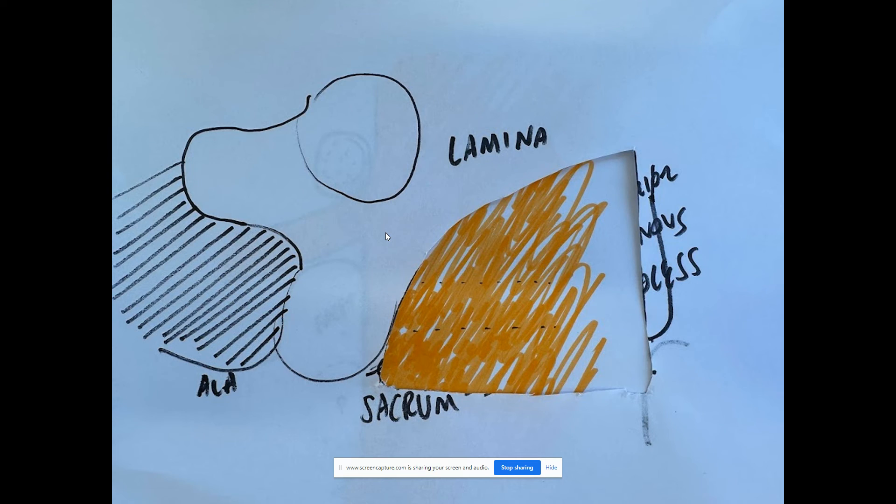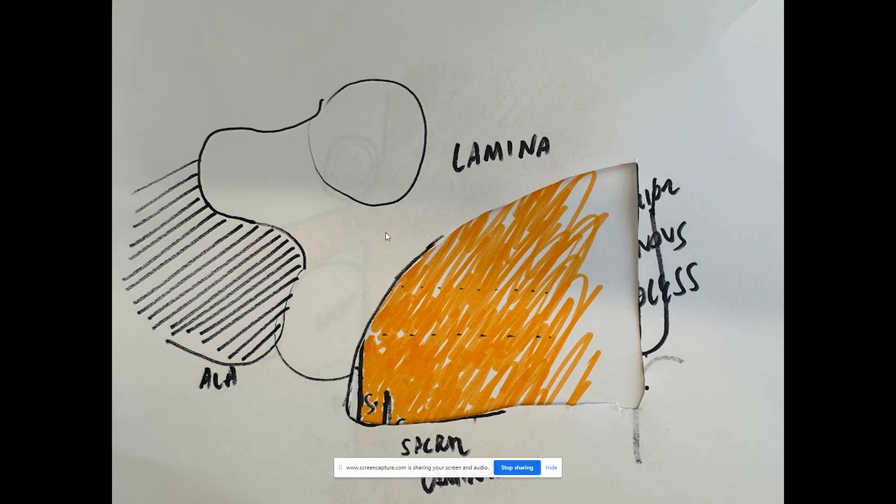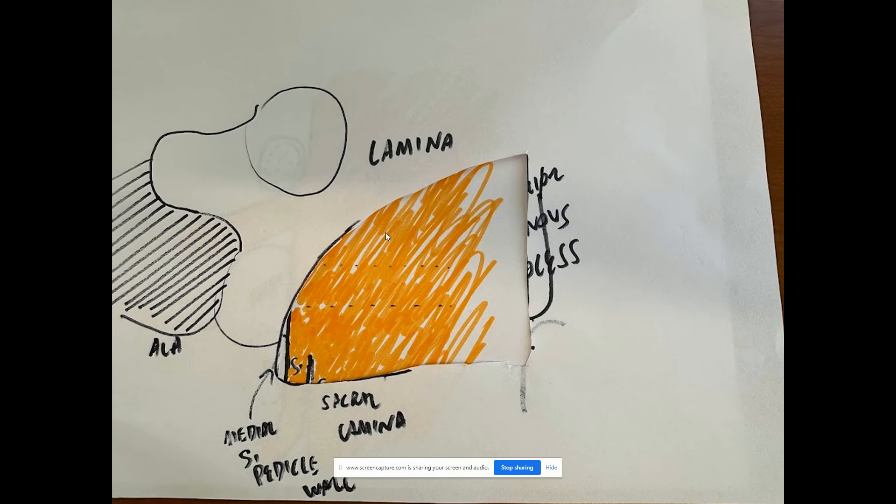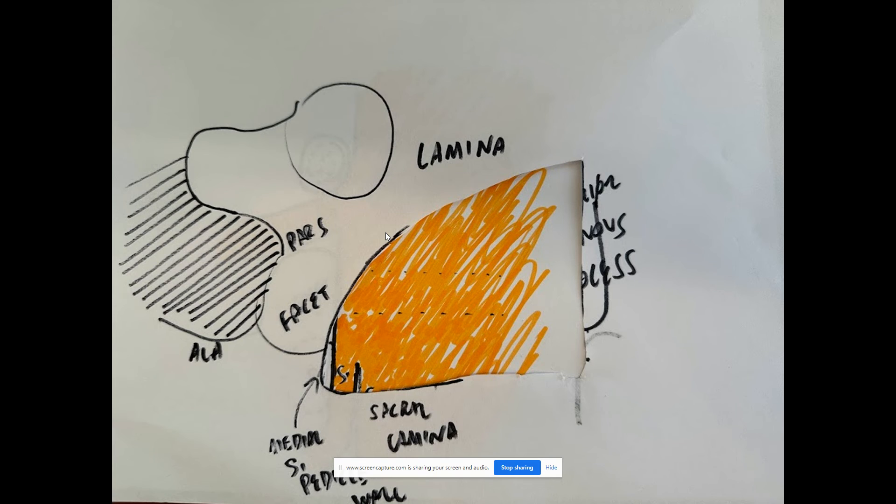Thinning, removing, thinning, and then removing until you find the S1 nerve root. You find the S1 nerve root, you can find the medial wall, the S1 pedicle, so you kind of know where you are. And then you start working superiorly. You also have to keep in mind not to excessively thin the facet and the pars to avoid fracture of the facet and the pars.